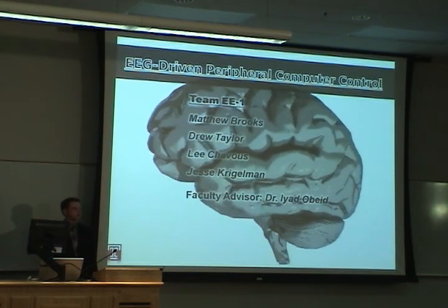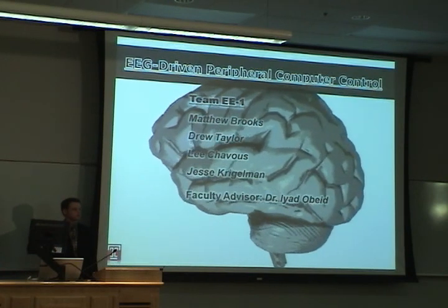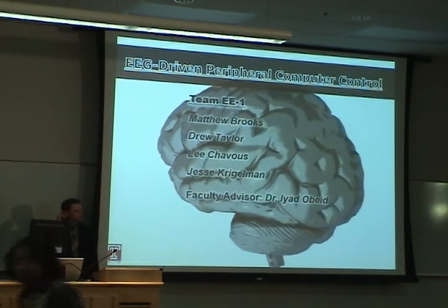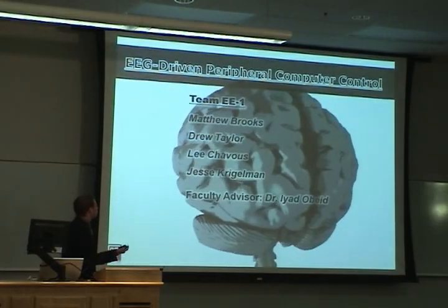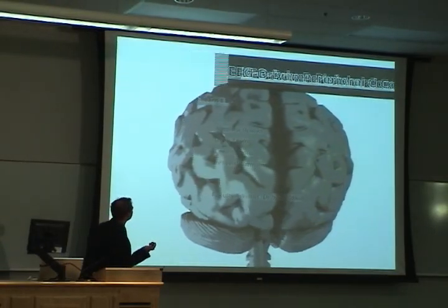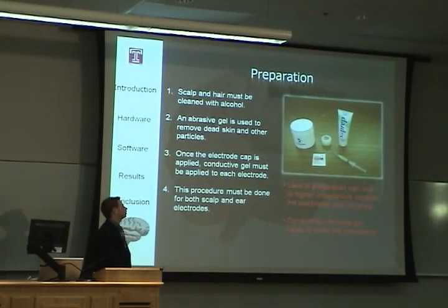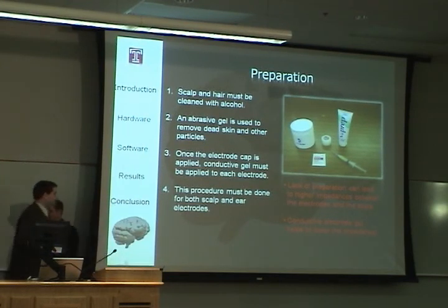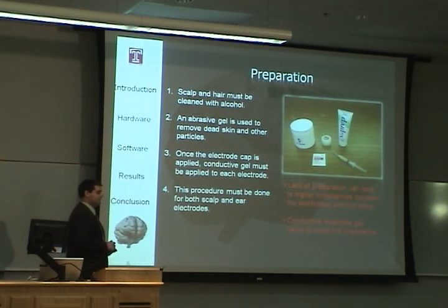Were there any steps you take to prepare the apparatus? Well, for the headgear, yes, we have a slide that we made about preparation. There's some procedure for preparing the head cap for use.